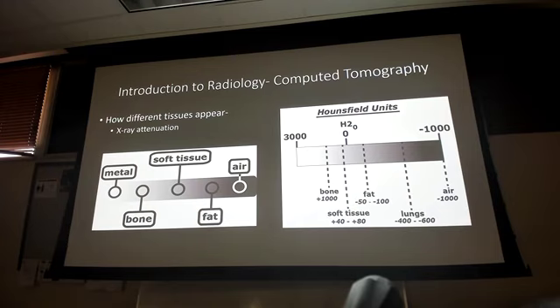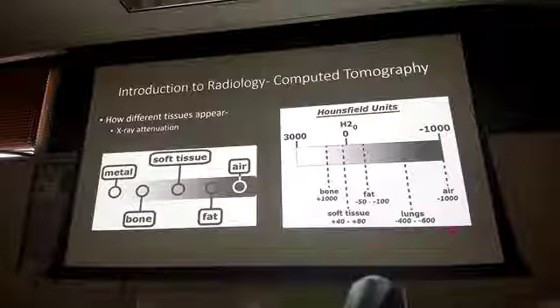Lungs, negative 400 to negative 600. Why? Because there is still tissue there, but there's still a lot of air there. If I were to take all the air out of the lungs, right? All of it, like a post-mortem patient, and do a CT scan, that lung Hounsfield is going to be more towards the 0, because it's going to be more dense because there's no air in the body whatsoever, right? But for us, and most of the patients you'll be doing, hopefully all of them, they won't be post-mortem. It's a bad day. And your lungs will be between negative 400 and negative 600.